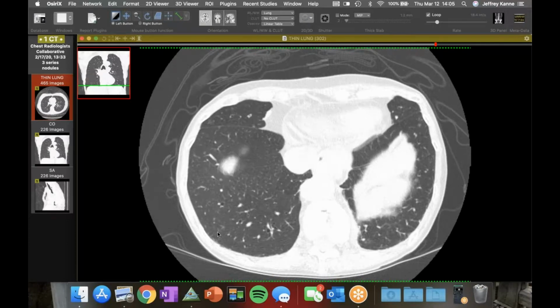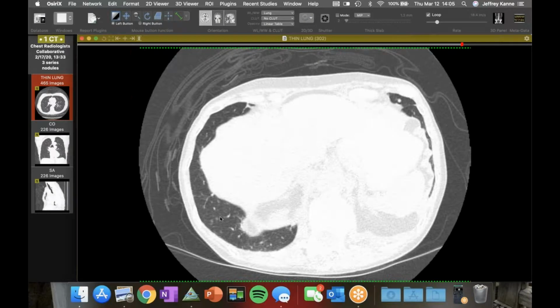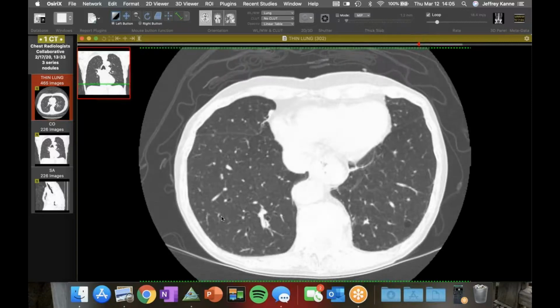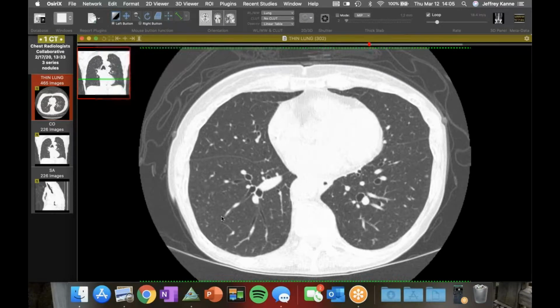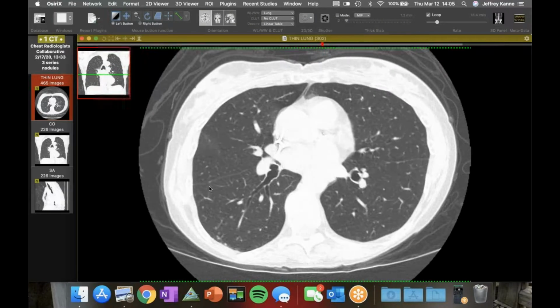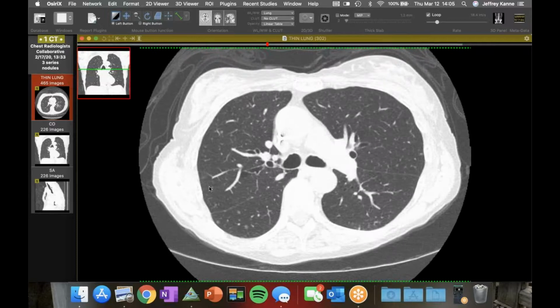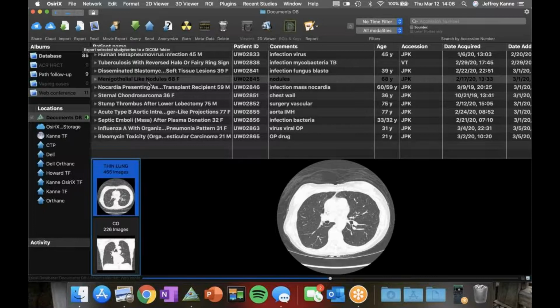And so I said these are meningothelial-like nodules, and I showed a path case of one last time, and then we've talked about, is this something you guys are comfortable just calling? But I don't know. What do you guys think? I mean, there's some airway stuff going on, but if you've got these kind of tiny nodules, kind of all throughout, stable, especially over many years, I think we're pretty confident. In a middle-aged or older woman in particular, yeah. Yeah, but I think this kind of look to them is very characteristic. Okay, I just wanted to follow up since we talked about that.